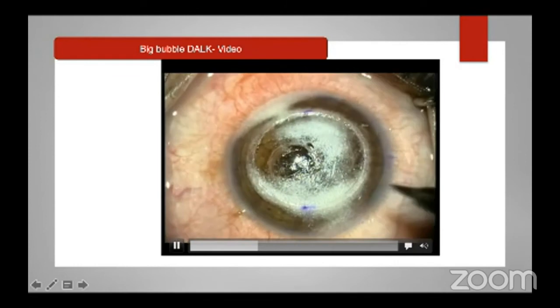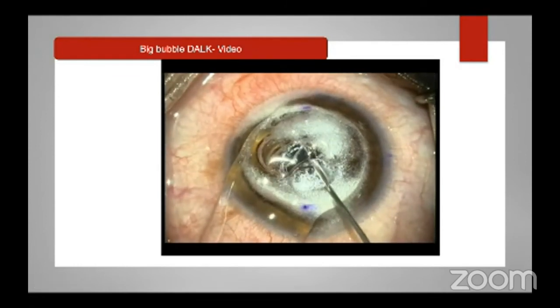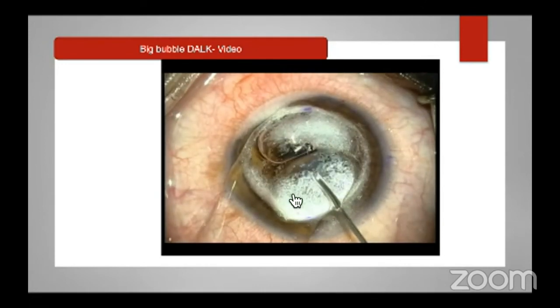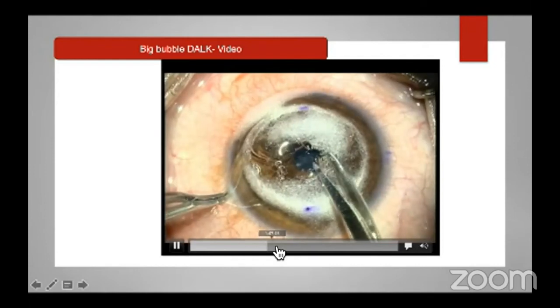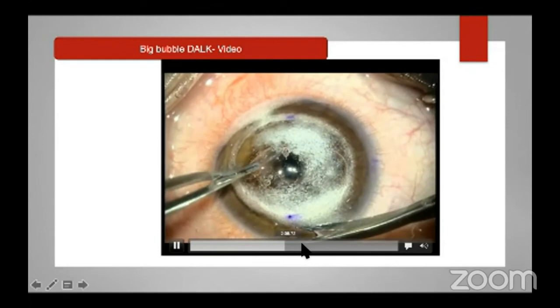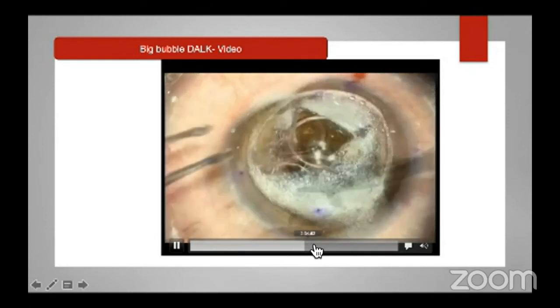I know that release has occurred. The Descemet's has shifted back to the stroma. Now we'll refill the space with the viscoelastic, and the central bubble will again shift to the periphery. And you can subsequently do a four quadrantic stromal cut in these cases to expose the Descemet's clearly and remove the entire diseased stromal tissue in a keratoconus patient.